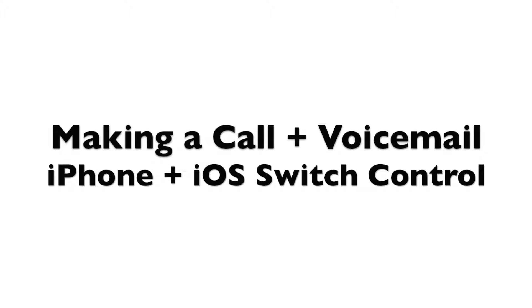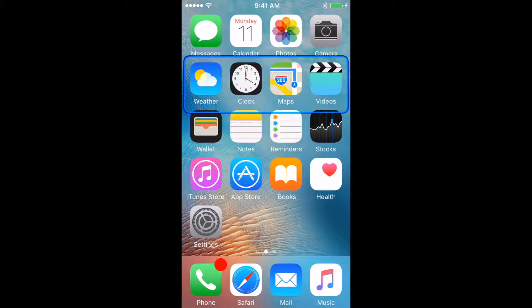Making a Call. This video shows you how to make and receive calls using iOS Switch Control with a single switch connected to the device through the Tekla Shield, with Auto Scanning and Group Items enabled. If using a single switch, you'll need to enable the Auto Scanning function in iOS settings. The switch is set up to perform the Select Item function in the Switch Control Preferences.